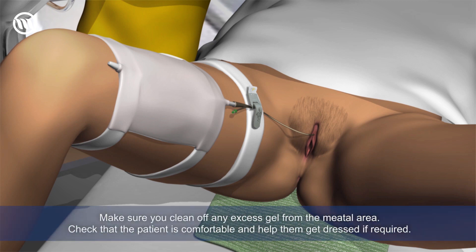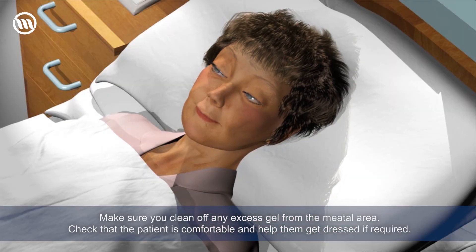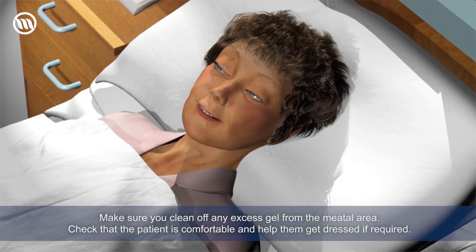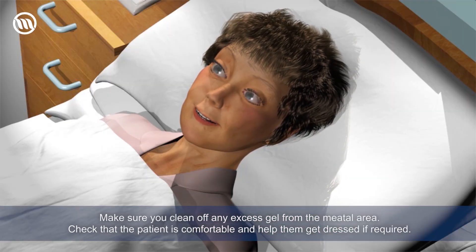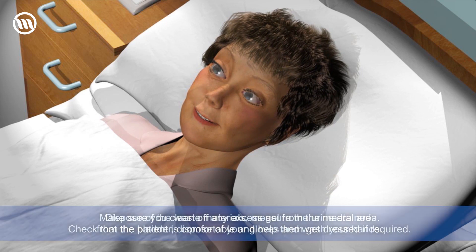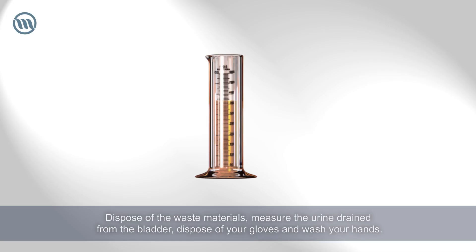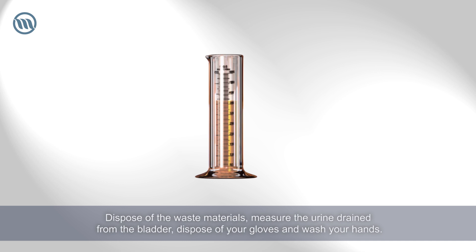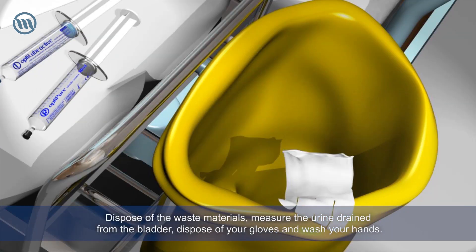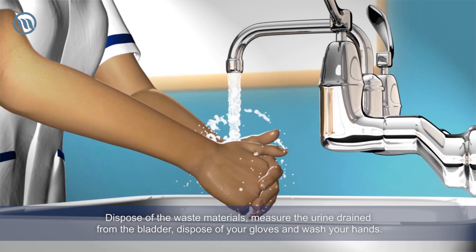Make sure you clean off any excess gel from the meatal area. Check that the patient is comfortable and help get them dressed if required. Dispose of the waste materials, measure the urine drained from the bladder, dispose of your gloves, and wash your hands.